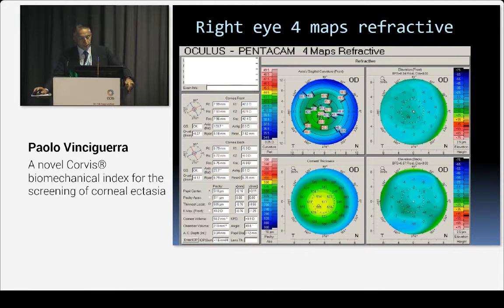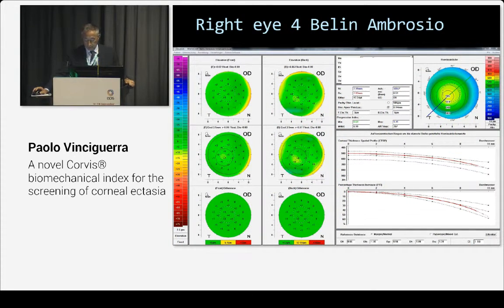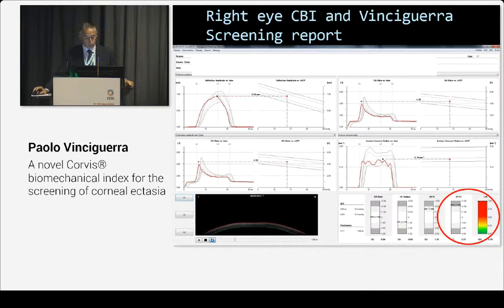Clinical example: this is the right eye. You can see the four maps — the curvature value is normal, the front elevation is normal, the posterior elevation is normal at only 7 microns, and the pachymetry is normal. All values are normal. Even the Belin-Ambrósio dataset shows everything is normal — no values show any offset, everything is green, telling you that you can be safe. But the Corneal Biomechanical Index showed a CBI in the red position — a very risky case — because the Corvis stiffness parameter is out of range, and fitting all other parameters together shows a risk.